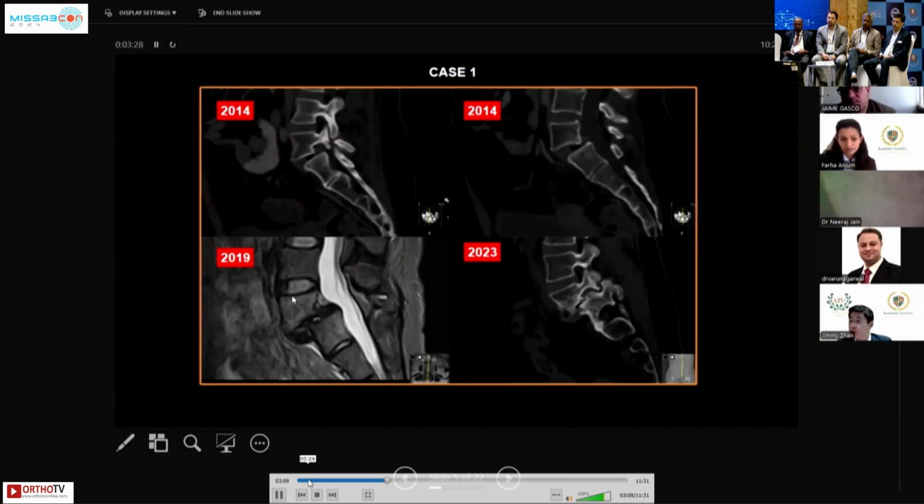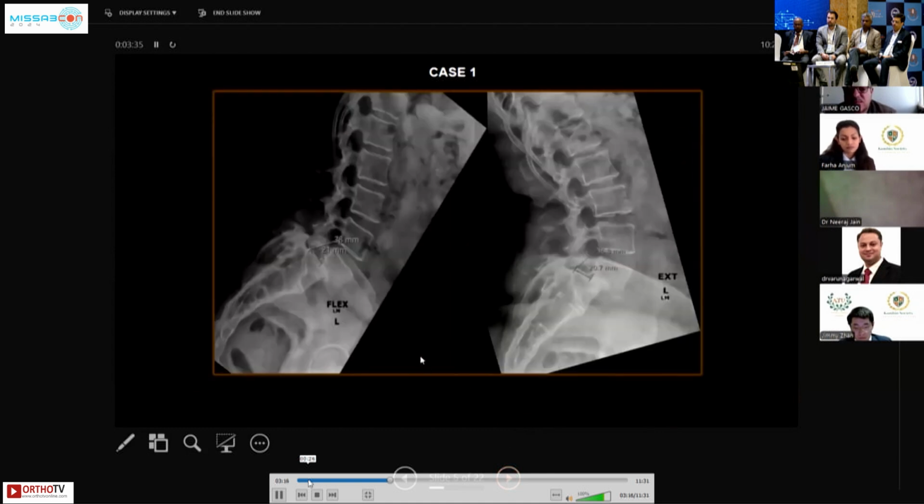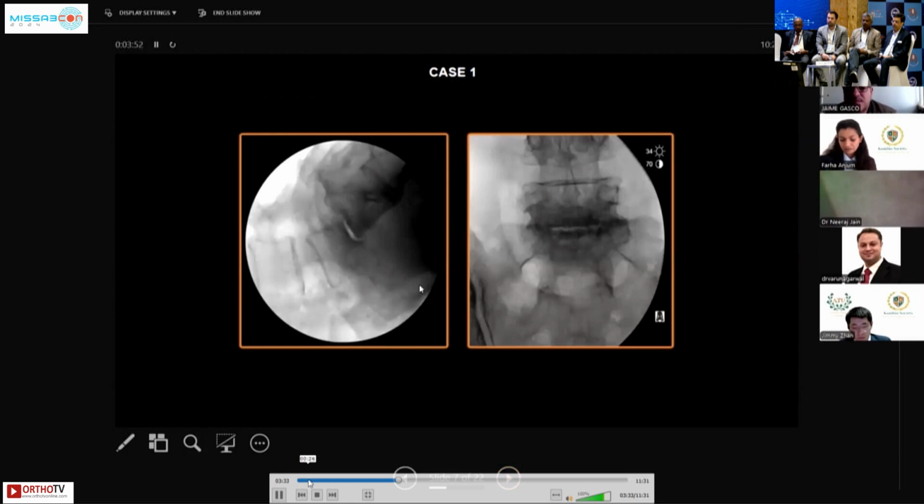And also from point C to point D, you can see that level of compression in the nerve and the amount of pain that she had was very significant. In flexion extension, she moved to what I would consider a grade 3, with what looked like almost auto-fused in that segment, but there's a little rim of bone gap that you can see there. So the footprint is very, very challenging.